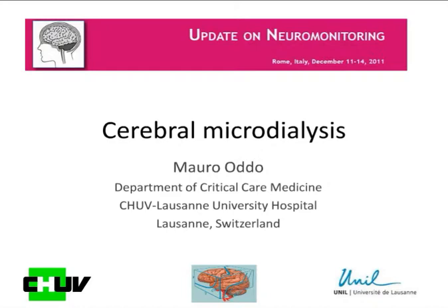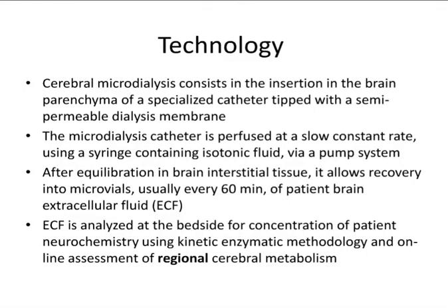I'm going to talk for these 20 minutes about a quite advanced system for cerebral monitoring. So we go from €6 to something a bit more expensive. 2,000. Yes, it's 2,000 euros. The technology by itself, I tried to make this presentation in terms of clinical or potential clinical utility, and if we have some time, I'm going to talk about some interesting data in terms of translational research.